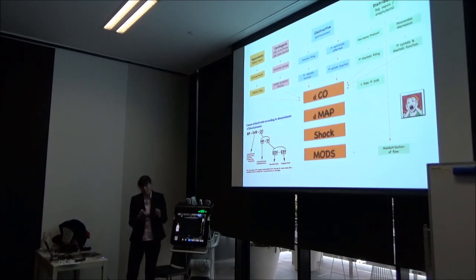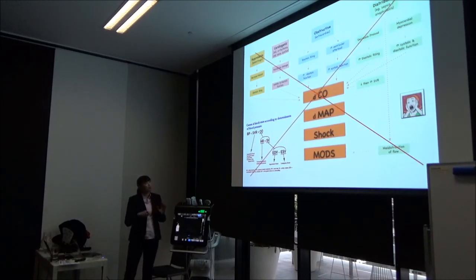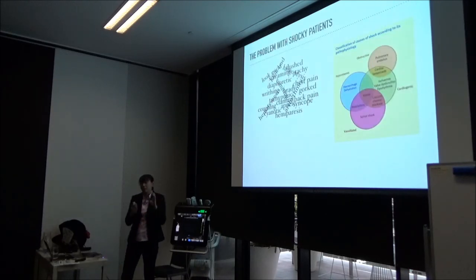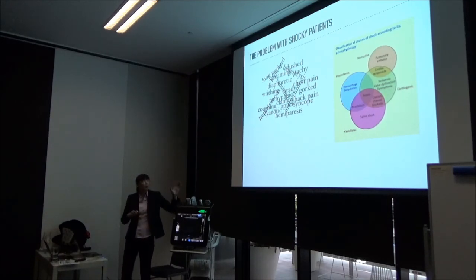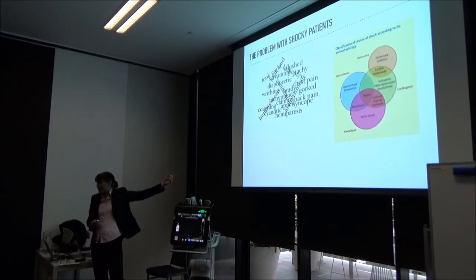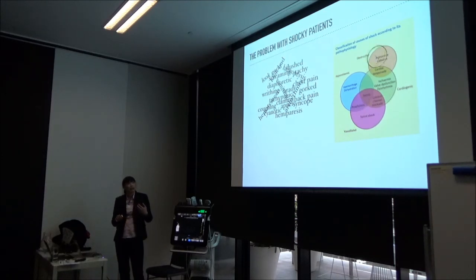And so the beauty of ultrasound is that we can cut all this out. Essentially what we're trying to do is look at parameters of these guys. But I don't think about patients in mathematical formulas. The other thing I don't like about the way we approach shock is that it seems like there are separate distinctions, when in reality, our shock patients can't talk to us sometimes. We can get no information, or we get too much information. And really, by the time they get to us, we're in a shock combination. So we're not dealing with one kind of shock.